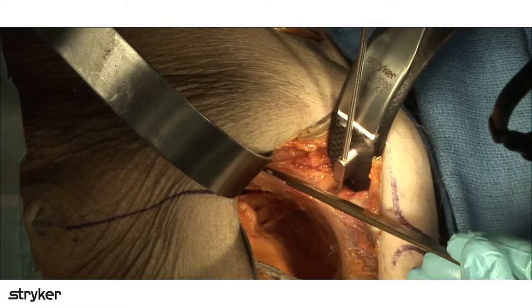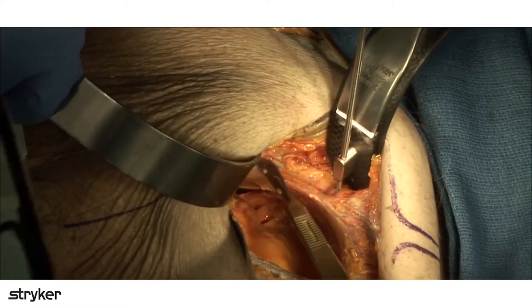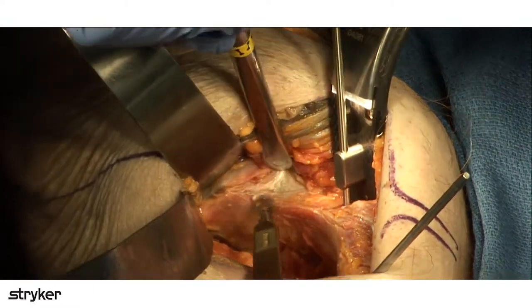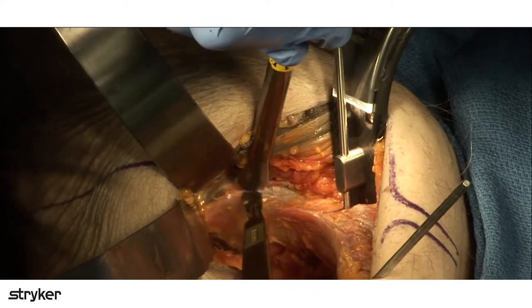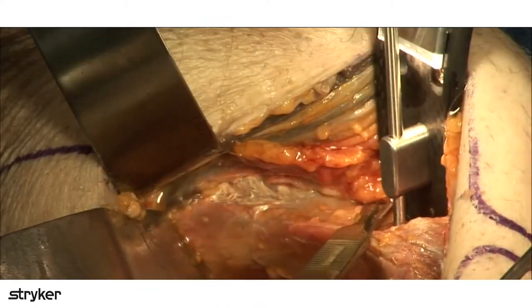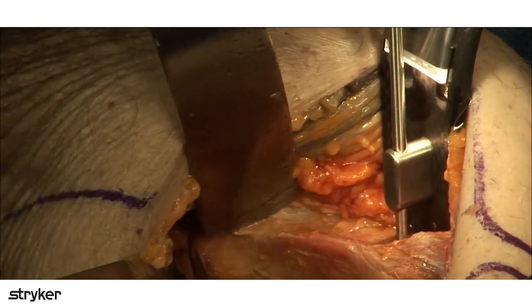So we're just going to come in here like this. All right, and I'm just going to release the iliacus muscle off the pelvic brim, and what we're going to do actually is take it all the way up over these hills and valleys.